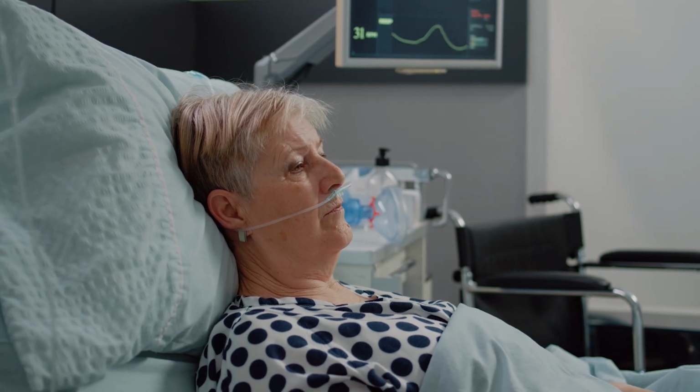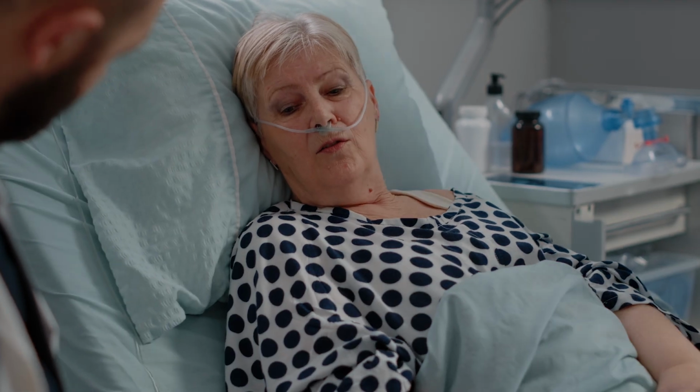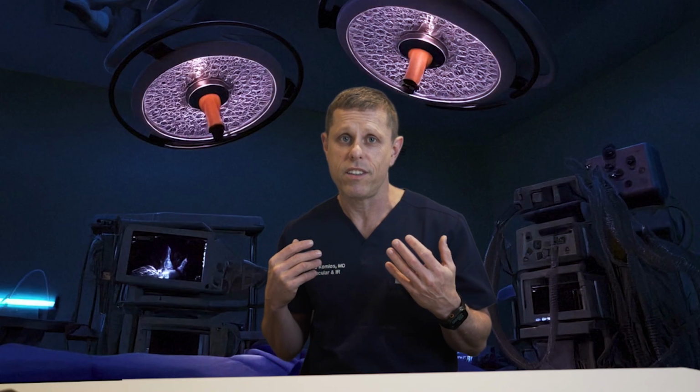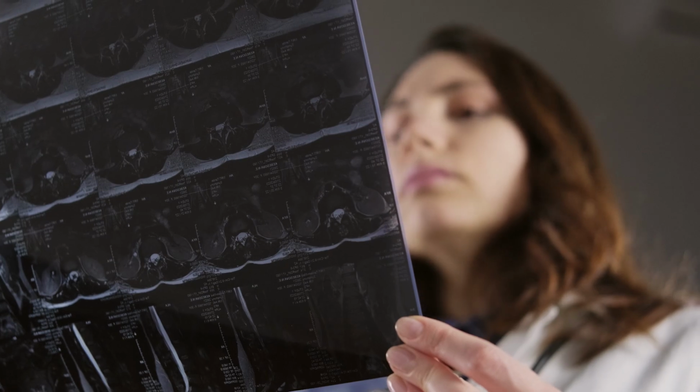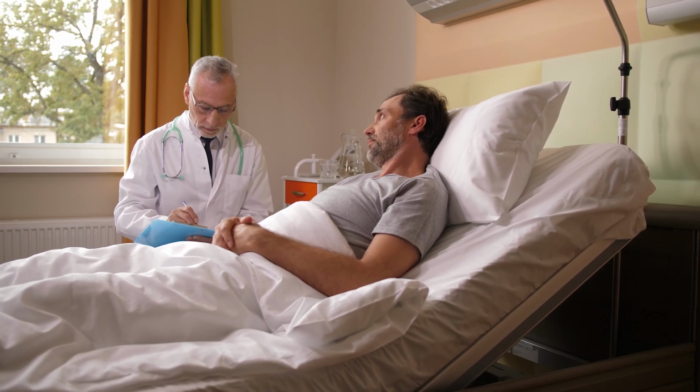And there is one more situation where filters may be necessary. Let's say you have a patient who has been laying in bed for a long time, so they are at very high risk for developing blood clots. In those situations, usually we use a blood thinner just to prevent blood clots. But let's say they had recent severe trauma, or they had a spine surgery and they are super sick and they cannot have any blood thinners.